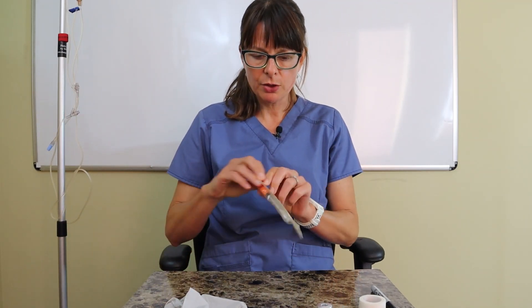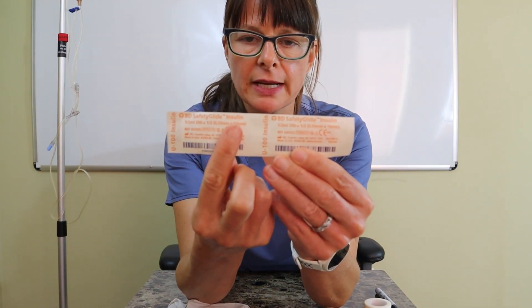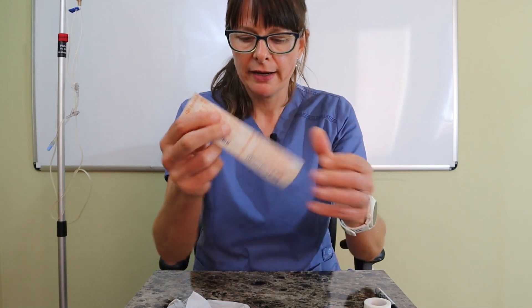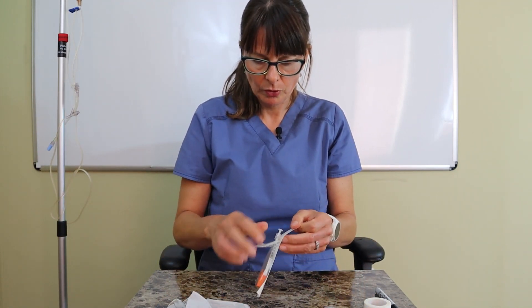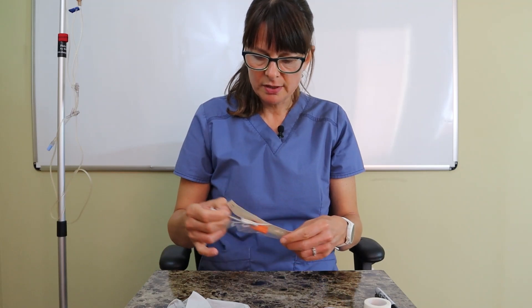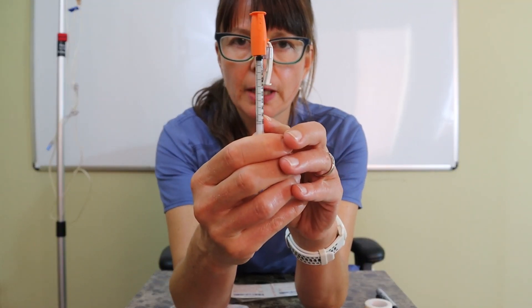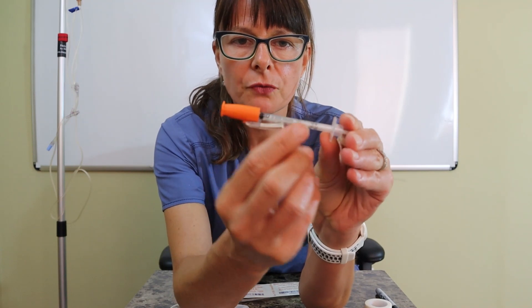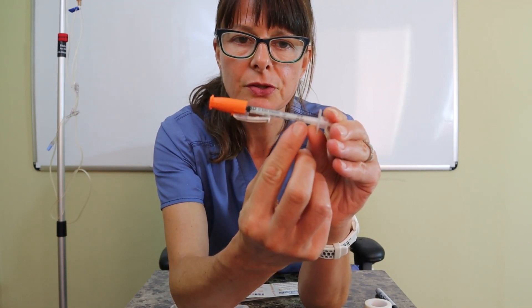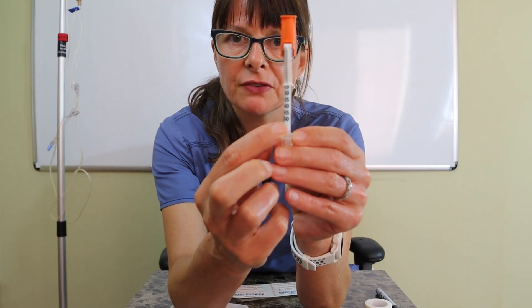Right away you can see that the syringe will tell you that it is an insulin syringe. When I open it up you can see that the units are very, very small. This particular syringe holds a total of 0.5 milliliters and a total of 50 units of insulin.